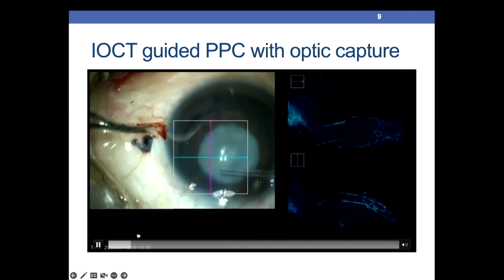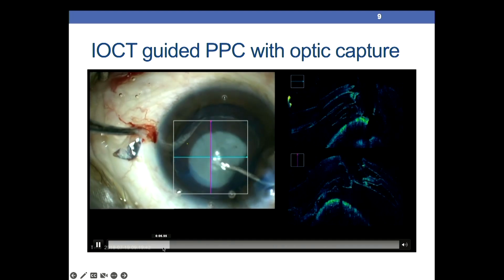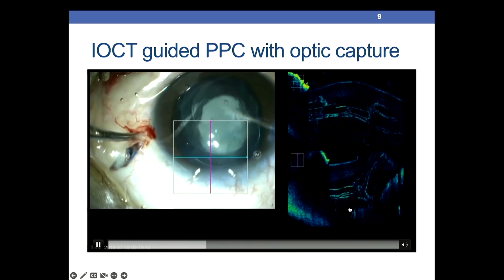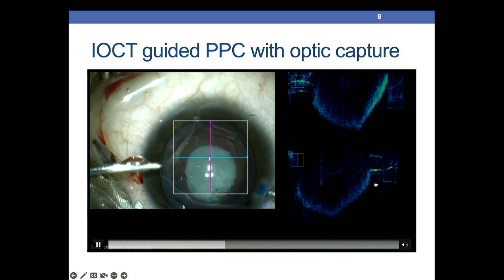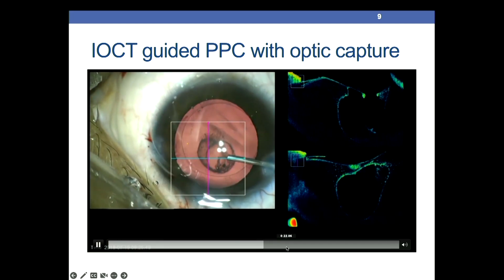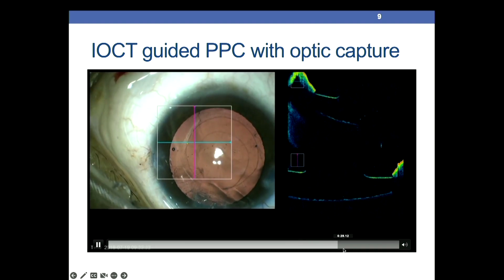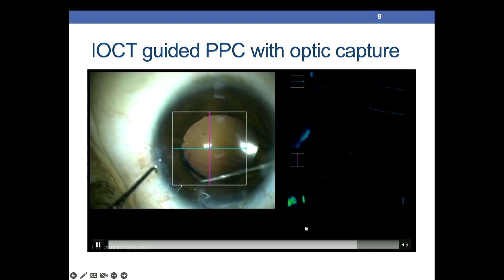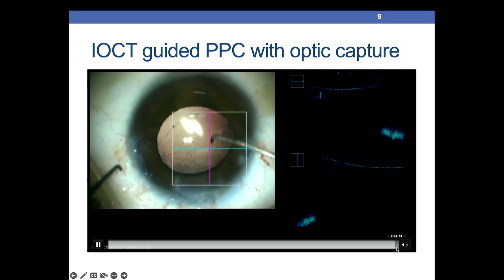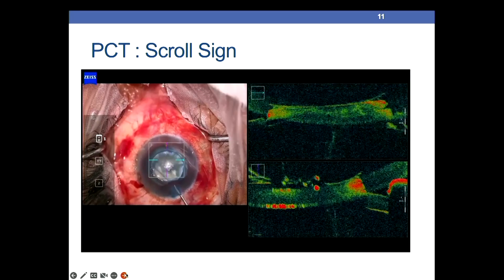Then in cases of posterior polar cataract such as this in a child, only hydrodelineation was done, no hydrodissection was done, but you notice that there is herniation of the posterior capsule behind. And so you know that you may have to put a 3-piece IOL in this case. This was converted, of course, into a posterior capsulorhexis. And then, again, you can see the PC and the anterior capsule and the posterior capsule there. And a capture was done. When you do a capture, both the capsules will appear taut on the intraop OCT microscope.